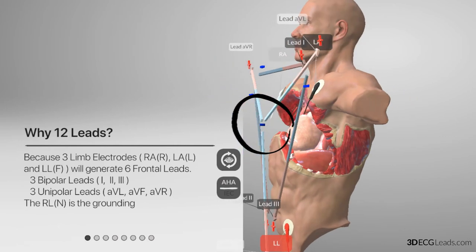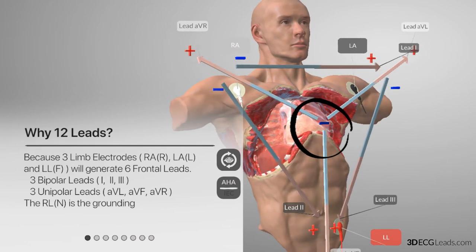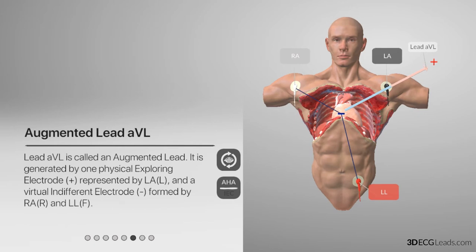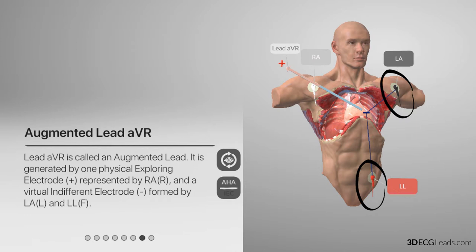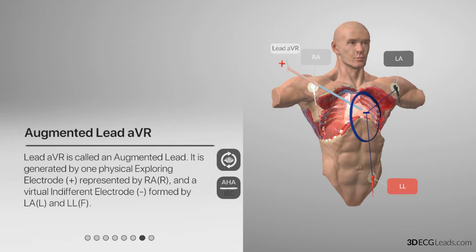Goldberger's central terminal is actually the reason behind the three extra augmented leads, and therefore the reason why a 12-lead ECG has only 10 wires. GCT is specific to the augmented leads and results from averaging the limb electrode leads that are opposing the augmented lead's positive electrode. As you can see here, in the case of AVR, LL and LA are opposing RA, which is the positive electrode. This average generates a negative virtual electrode situated more towards the middle of Eindhoven's triangle, enabling it to generate a different angle.